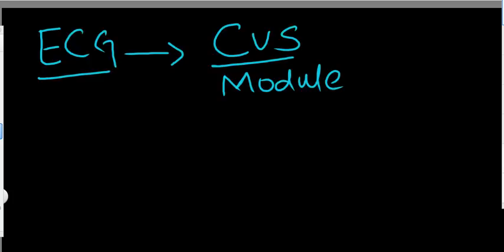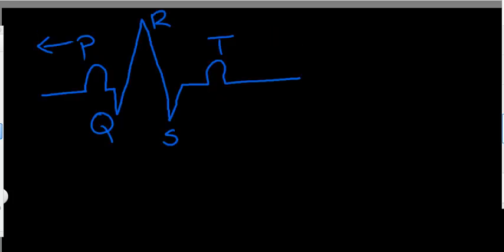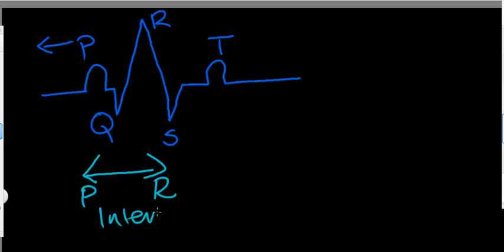Now let us step into another segment, the PR segment, and the PR interval. There is a difference between the PR interval and the PR segment.